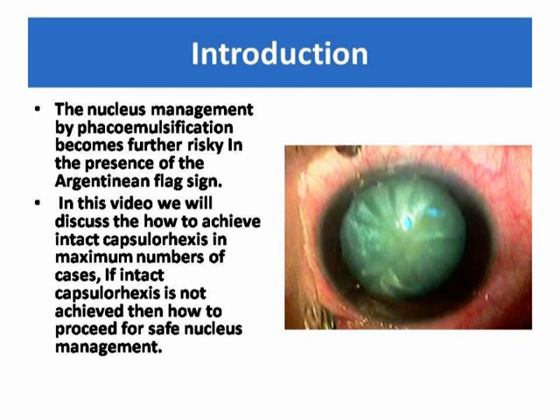Nucleus management by phacoemulsification becomes further risky in the presence of the Argentinian flag sign. In this video, we will discuss how to achieve intact capsular rhexis in the maximum number of cases, and if intact capsular rhexis is not achieved, how to proceed for safe nucleus management.